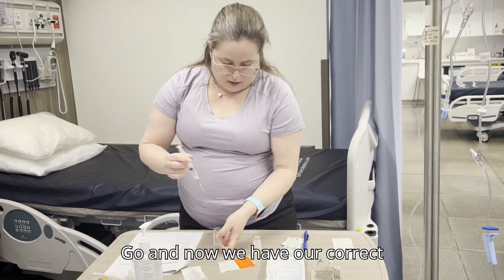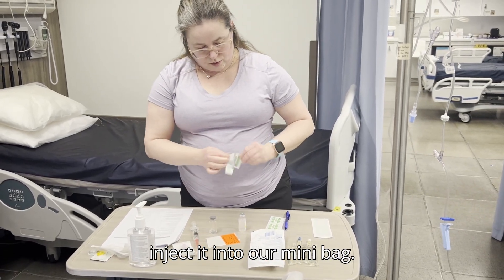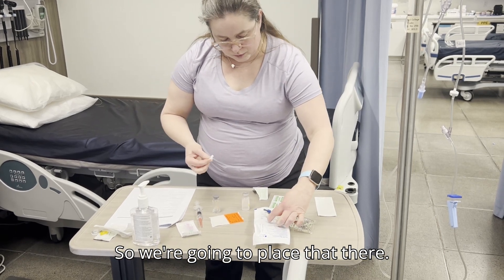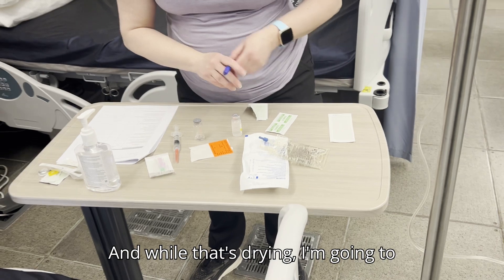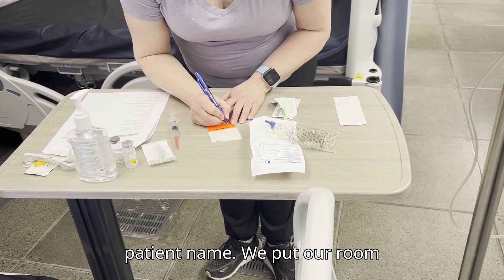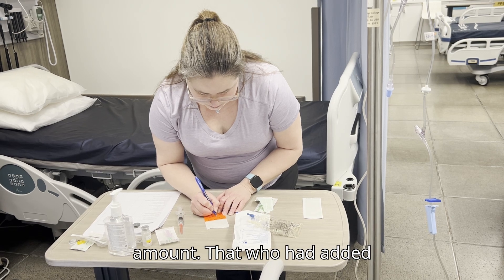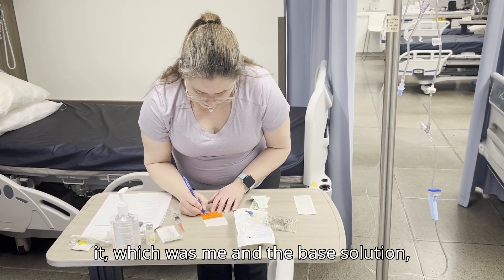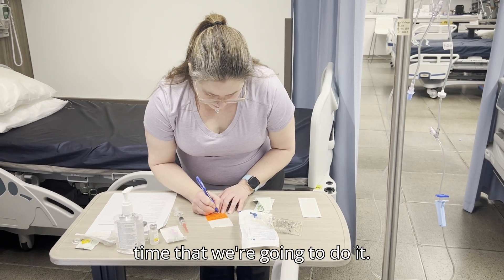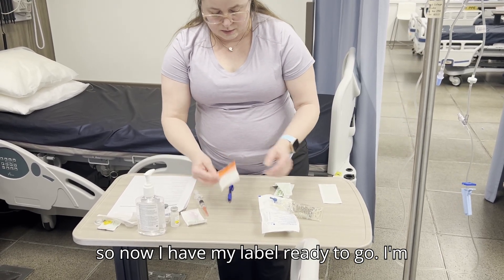Now we have the correct volume in our syringe ready to be injected into the mini bag. Before we do that, we must clean this hub — actually rub it and let it dry. While that's drying, I'm going to fill out the medication added label: patient name, room number, the medication and amount added, who added it, the base solution (normal saline), the date, the time, and the start time.